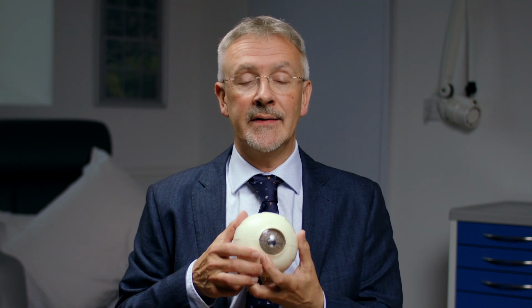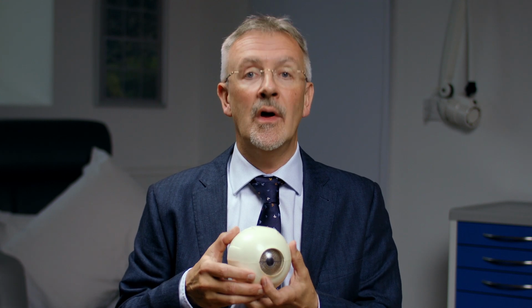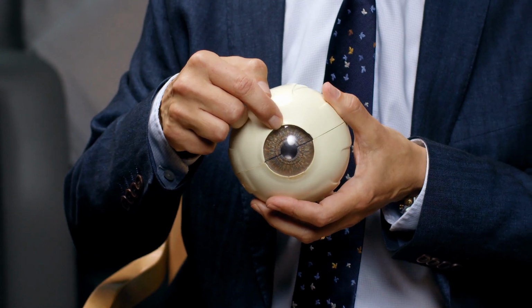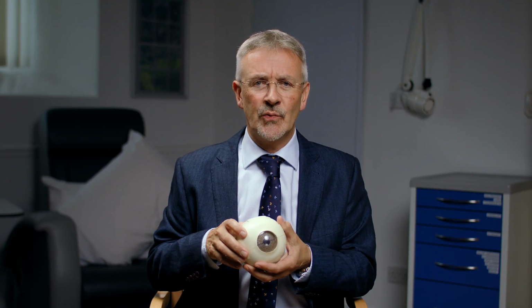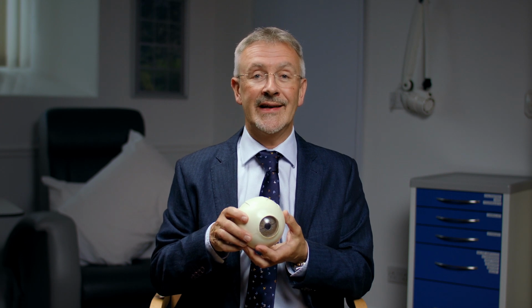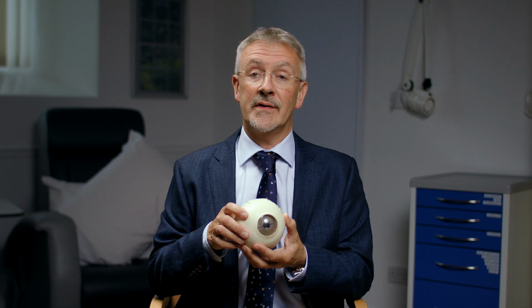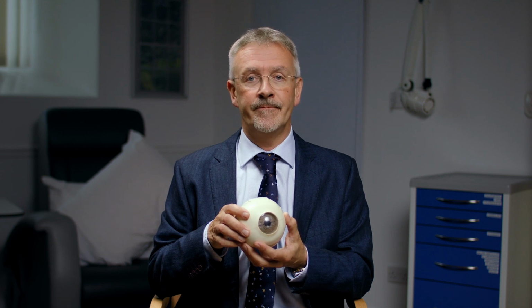What happens during cataract surgery? Cataract surgery is typically performed using a technique called phacoemulsification. We make a tiny incision in your eye, often less than 3 mm in size. Through this incision, we insert an ultrasonic probe to gently liquidize and separate the cloudy lens into small pieces, which are then carefully suctioned out of your eye.